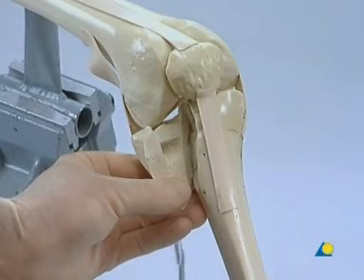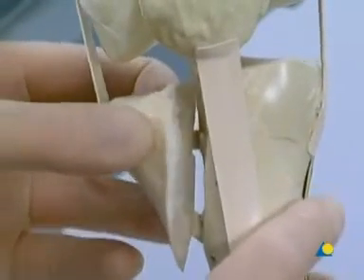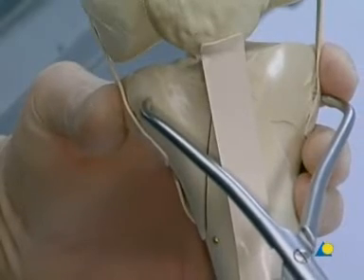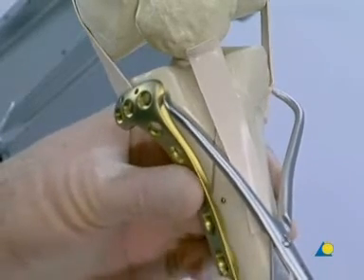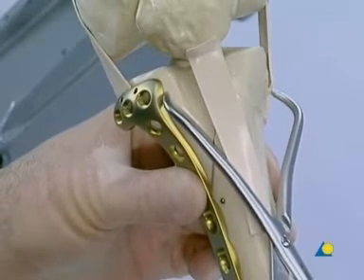The central impaction is elevated with a pusher. After reducing the lateral construct, the reduction is held in place using the large pointed reduction forceps. A 4.5-5.0 LCP proximal tibial plate is placed to support the lateral condyle by buttressing it. Alternatively, either a T buttress plate or a tibial head buttress plate can be used.